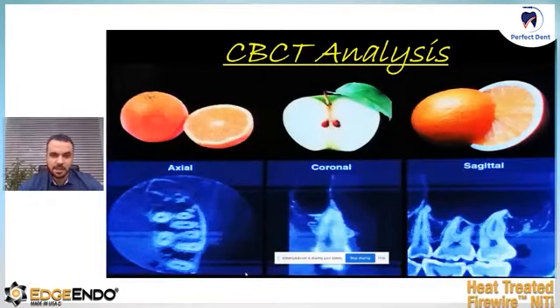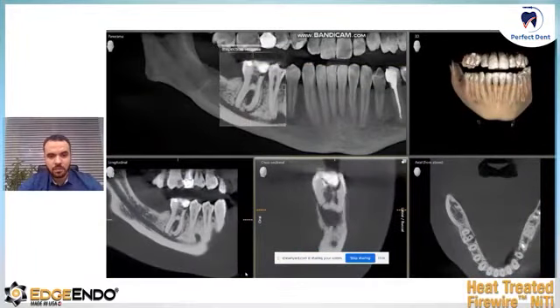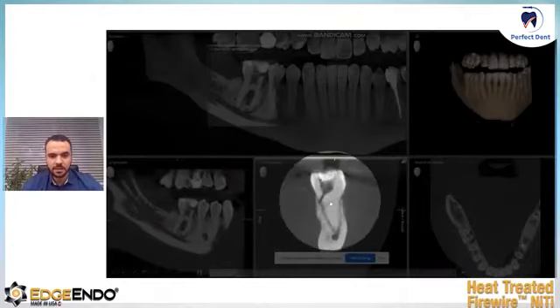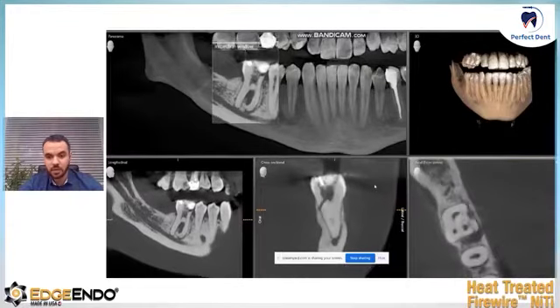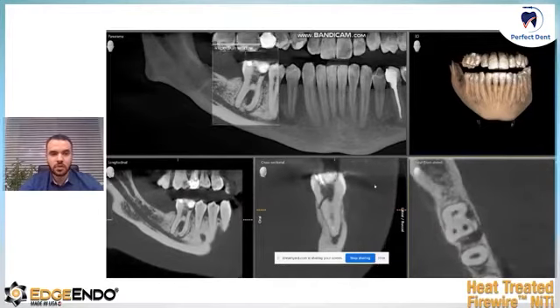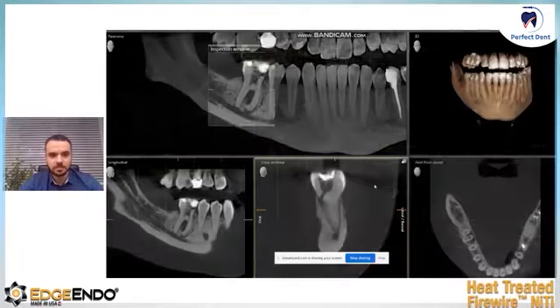When the patient was referred to me, I sent him to make a CBCT. CBCT is one of the important steps in diagnosis, and if we're facing a problem with the patient, it shows through the axial, coronal and sagittal views. Here we go. In the cross section, I found the vertical root fracture here, and in axial we also found cracks extending to the vertical root fracture. So excessive taper in such a severely curved root ended up with vertical root fracture or cracks extending to vertical root fractures, and at last the tooth will be extracted.